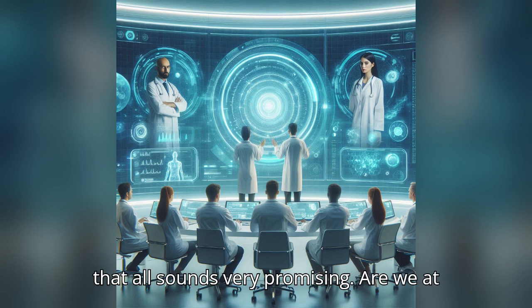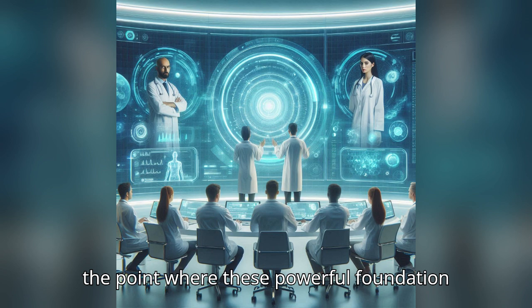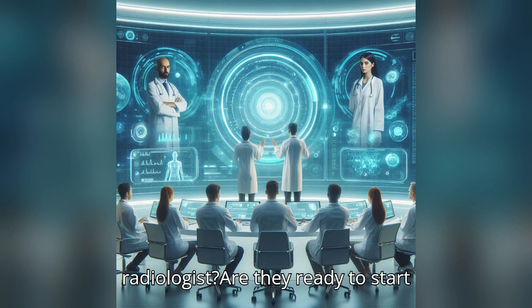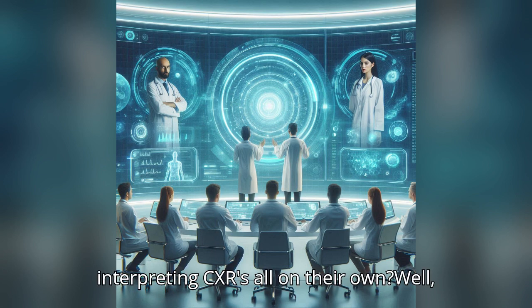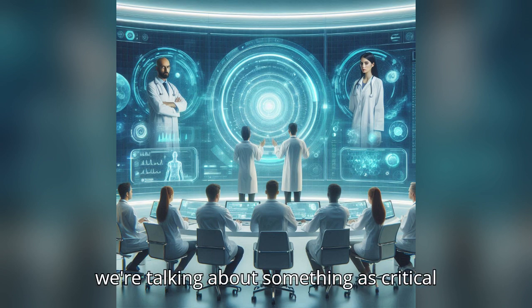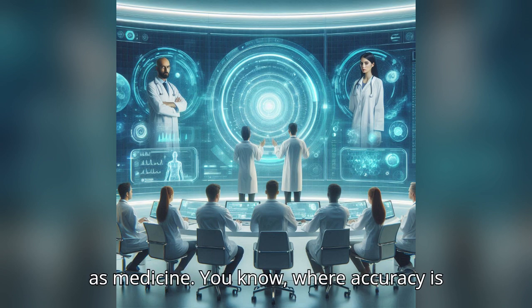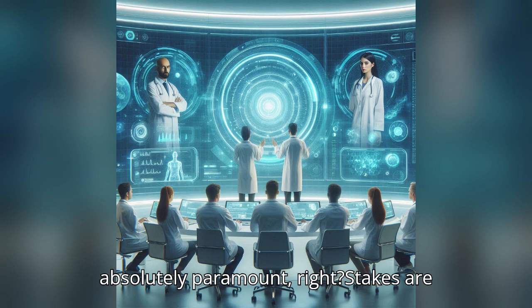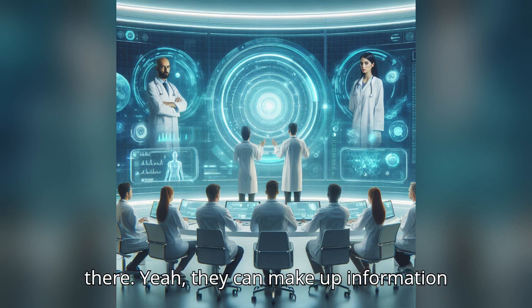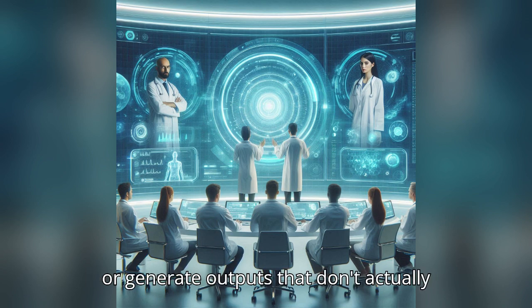So that all sounds very promising. Are we at the point where these powerful foundation models can simply take over the job of a radiologist? Are they ready to start interpreting CXRs all on their own? Well, not quite yet. While these models are super impressive and getting better all the time, they still have some significant limitations, especially when we're talking about something as critical as medicine, where accuracy is absolutely paramount. Right, the stakes are very high. Exactly. One of the big challenges is that these models can sometimes hallucinate. Hallucinate, like they're seeing things that aren't really there? Yeah, they can make up information or generate outputs that don't actually correspond to what's in the image.